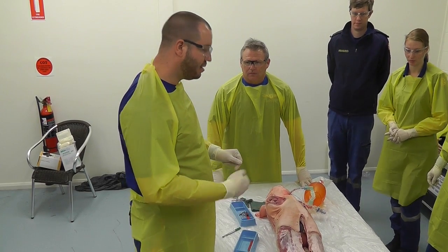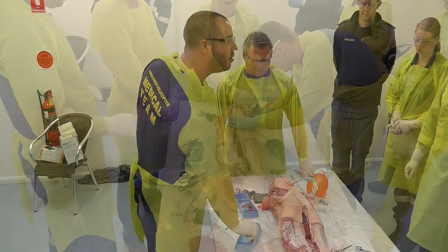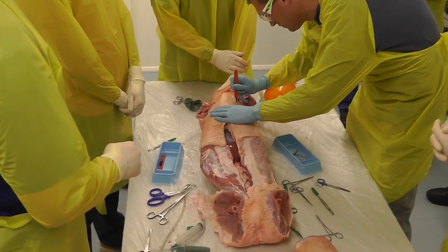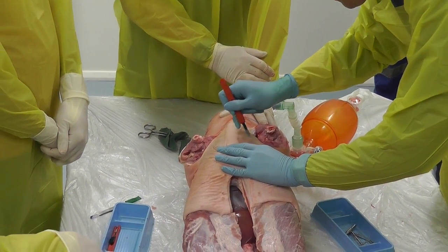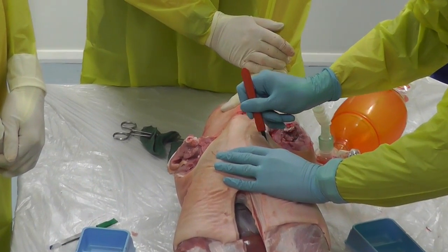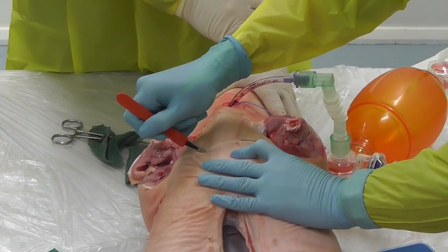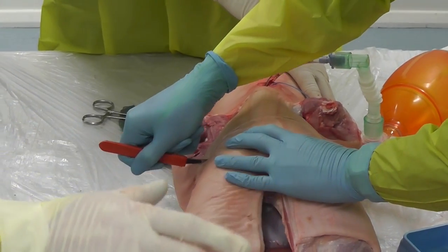We are going to go through this now slowly, step by step, so that everyone has a chance, and we will sub people in and out. Keep your fingers away so that it does not make you slip — you are not going to go through your finger. Remember, it is not going to be a straight line — it is going to be almost a little bit of a butterfly incision. As you make that incision through the skin tissue in real, living or freshly dead people, that skin will spring apart, giving you good access to what you are doing.